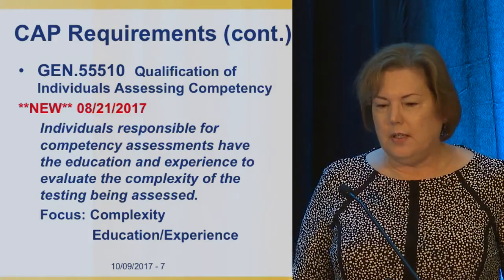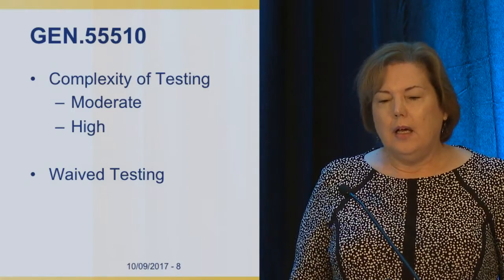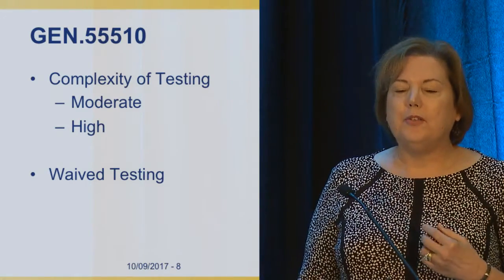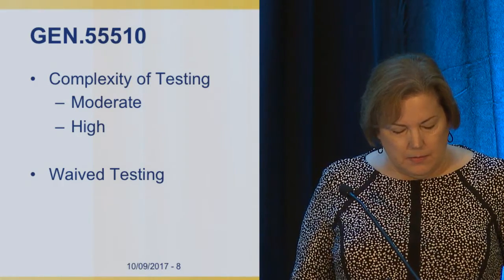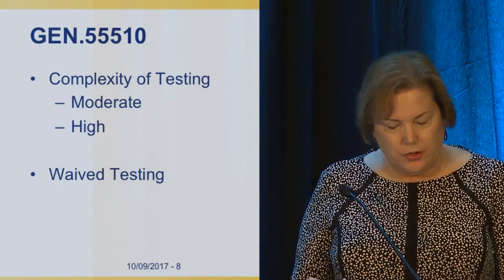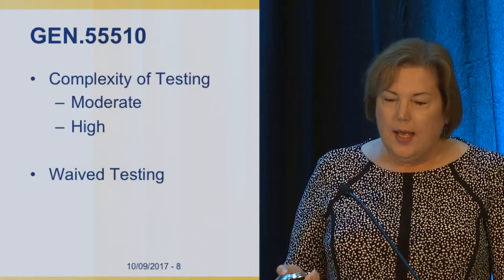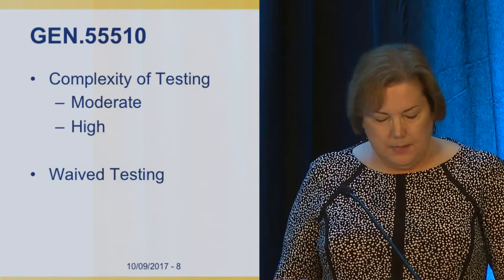Okay, so let's go on a little bit about the complexity. So there's moderate and high. Hopefully most of us know that most of our tests fall into the high category, and that makes us a little bit more stringent on what personnel can actually do the assessment, the education and experience, which I'll get to a little bit later. And then the waived testing, which I'm not going to talk about, but Lorraine will touch a little bit on that in a bit.